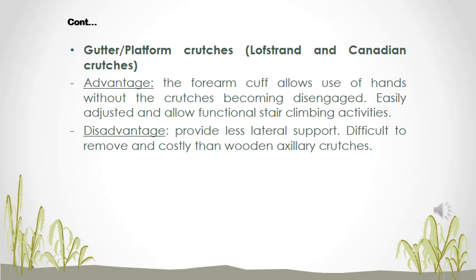Gutter platform crutches are another type of crutches. The advantage of this is the forearm cuff, where your forearm rests on the crutch, which allows use of the hands without the crutches. It's easily adjustable and allows for functional stair climbing as well. The disadvantage is that it provides less lateral support, is difficult to remove, and is more costly than wooden axillary crutches.